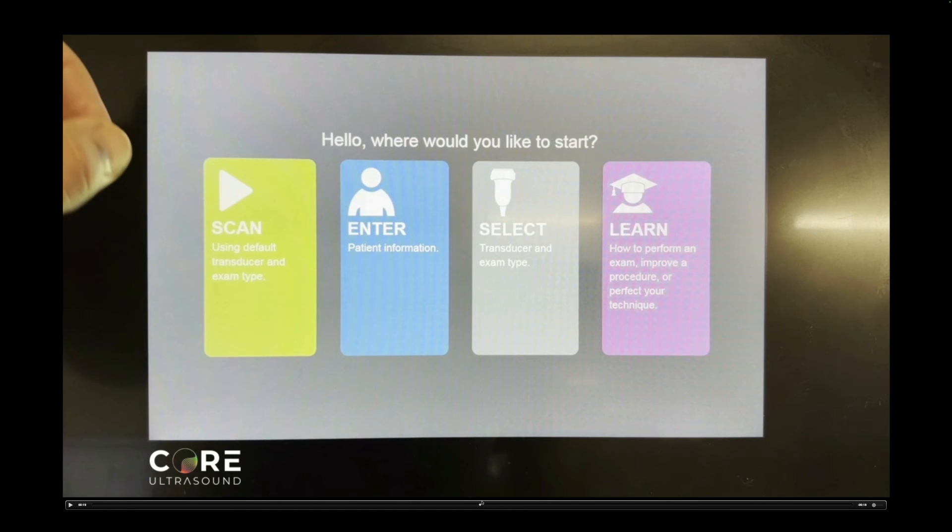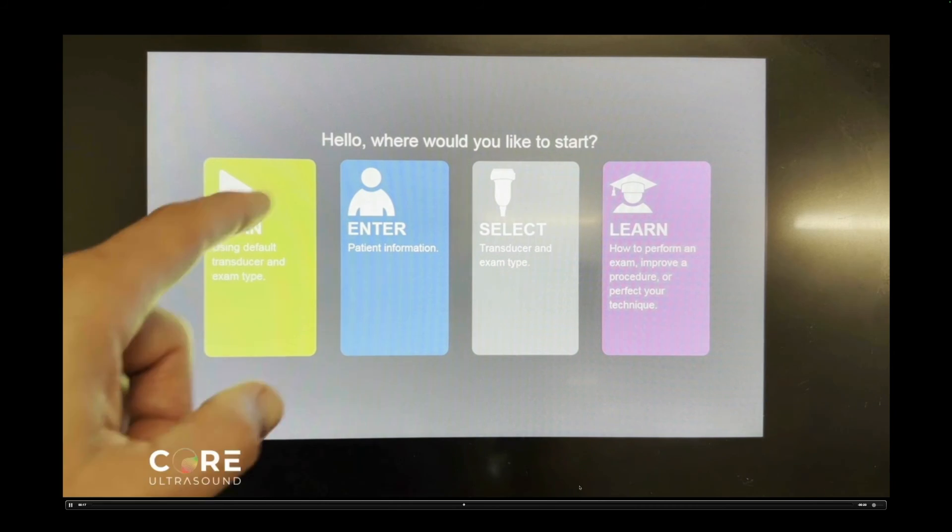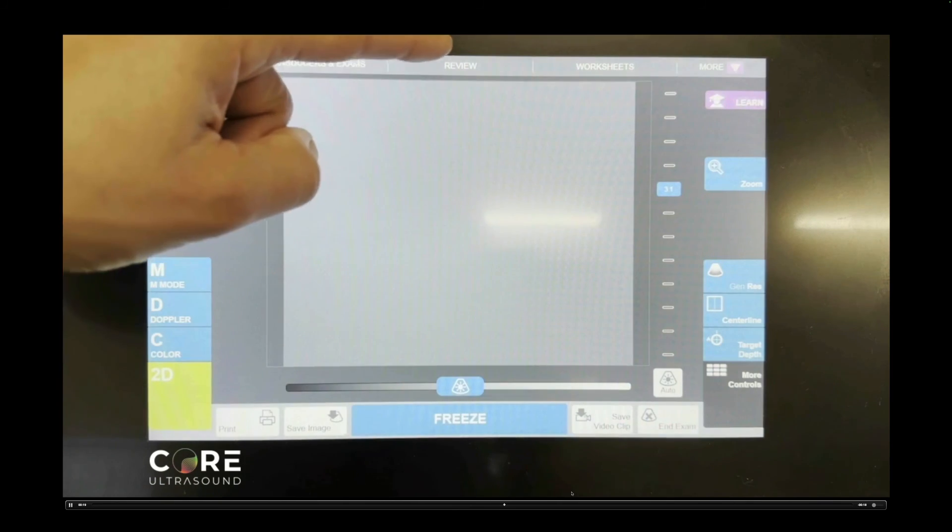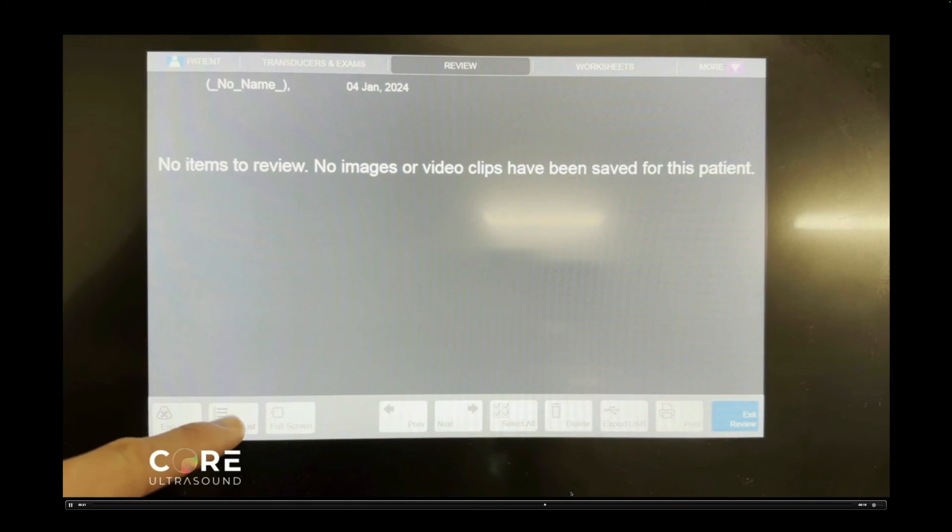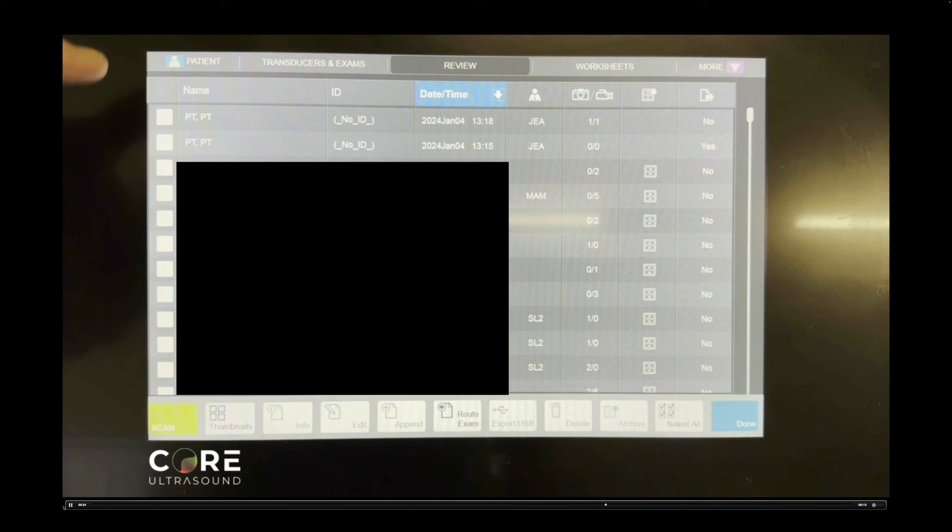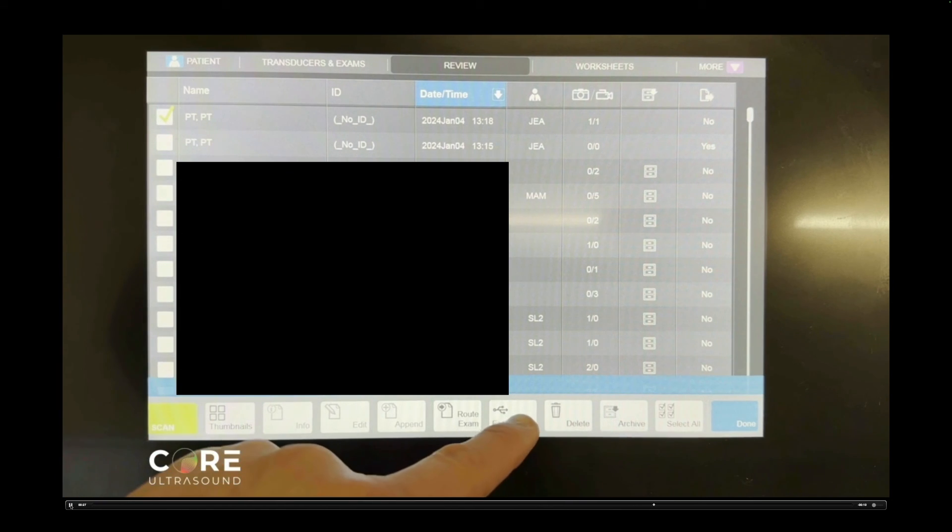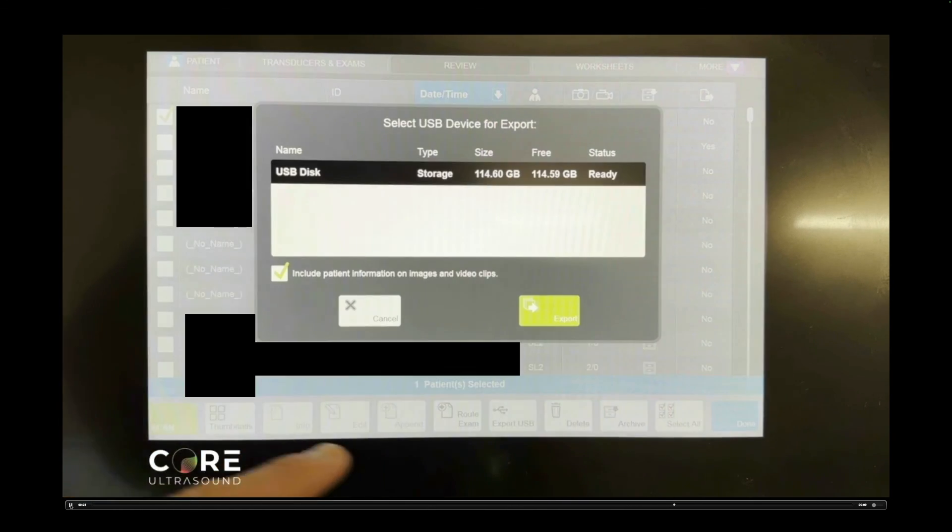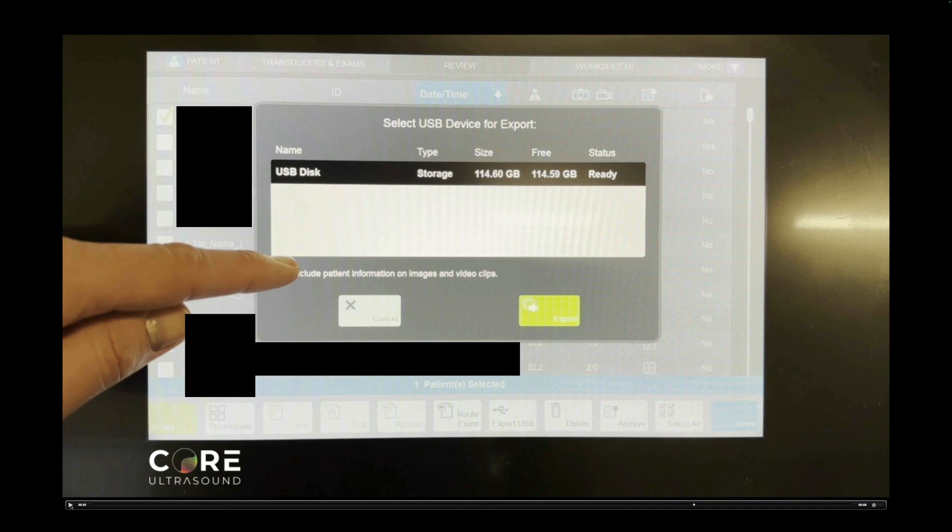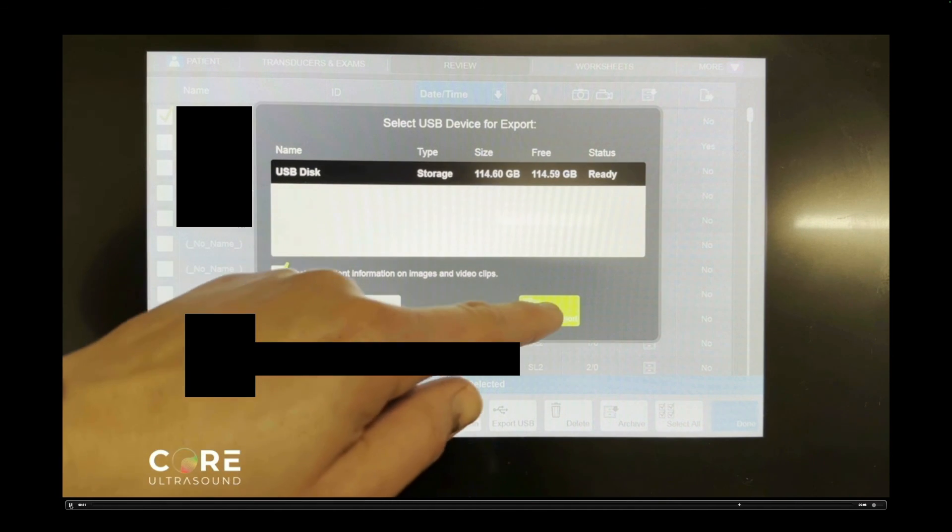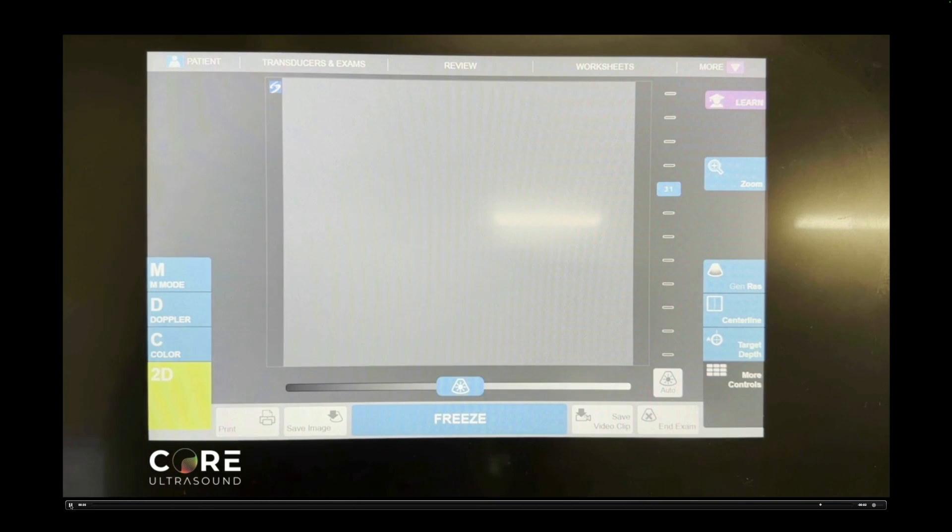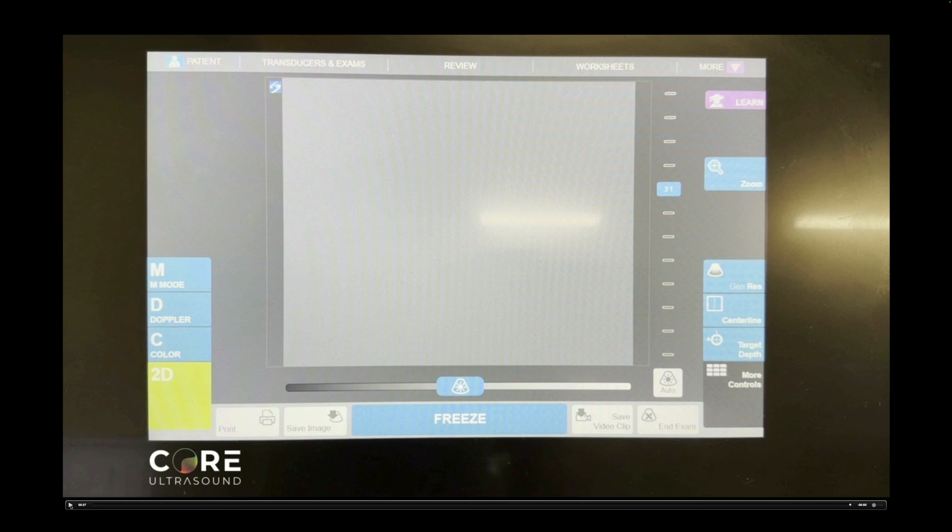Now, after you end an examination, you're going to basically be taken back to this page and you can kind of start over. But if you're ready to export your clips, what you'll do is you'll just hit either scan or enter patient information, and you'll get to this screen, which we're familiar with. You're going to hit the review button and then patient list. And it's going to give you all of the ultrasounds that were done to get your clips exported. You're going to select the ones that you want. I'm going to select this one over here, the top one, I'm going to click that and then hit export USB. And then it is kind of ready to go over here. You can choose to include or not include the patient data and then hit done and wait for that to export.